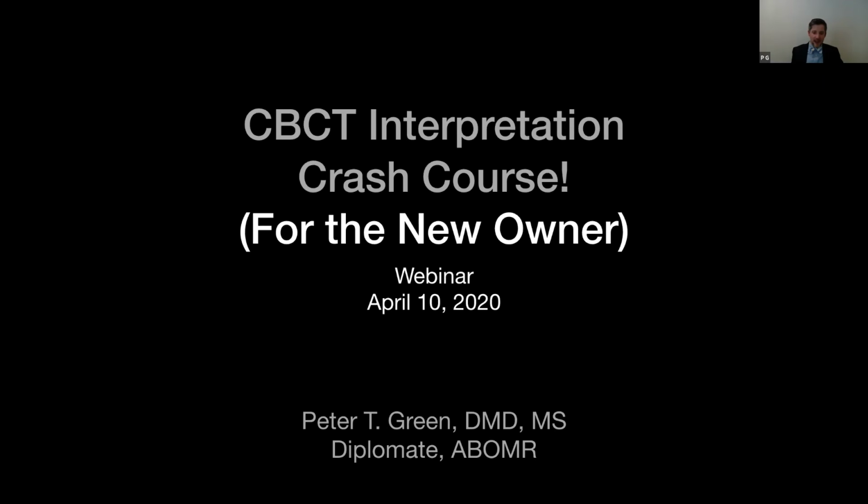So for the next hour, we'll talk about cone beam CT with an emphasis for newer owners. So either you just bought one or you're thinking about buying one. And if you're an experienced owner watching this, I hope you still can take home some pearls. And if you're watching and you're on the fence about buying a cone beam machine because you're afraid of missing something, my goal is to bring down that barrier so you're more comfortable with using the technology.